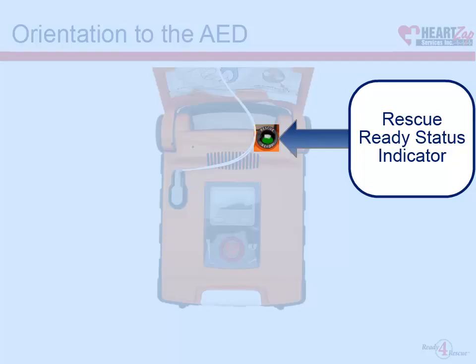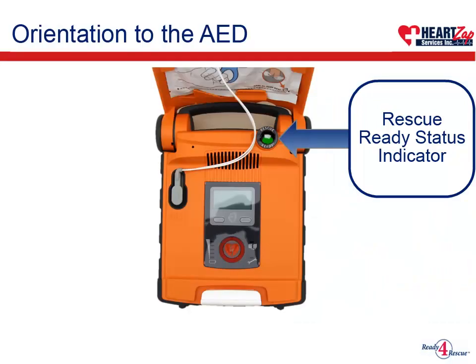Rescue Ready Status Indicator. When the status indicator is solid green, the AED is rescue ready. Rescue Ready technology assesses the AED, battery, and pads to ensure they are ready to perform a rescue. If the status indicator displays a red X, the AED is not rescue ready and it has failed its latest self-test.